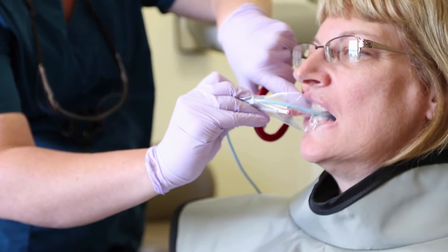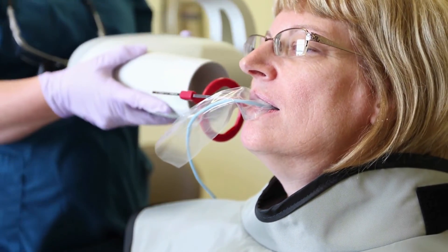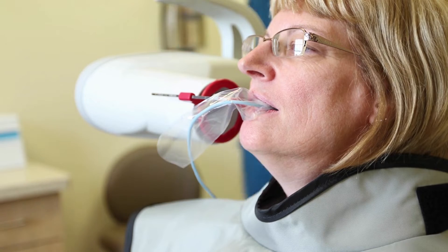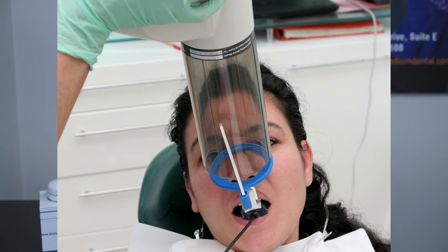This wired sensor technology is outdated. The wired sensor is as ancient as an old wired phone. Big manufacturers don't want to innovate — they'd rather keep selling the same old traditional wired sensor technology. They keep making technology cheap and selling it to dentists at a very high cost. Manufacturers have not wanted to change their manufacturing lines, so instead they just keep rebranding the same technology. The wire has been an inconvenience for over 20 years in the dental industry, from the comfort standpoint with patients and the cost from damage.